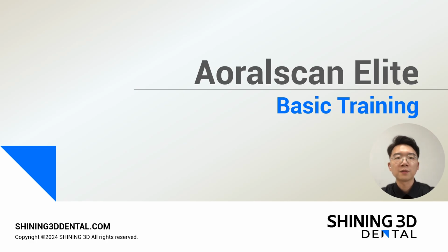The third part of today's basic training is the preparation part. We will give you detailed information about the implant system, the software and the PC, the scanner testing and practice, the scan body sterilization, and so on and so forth.